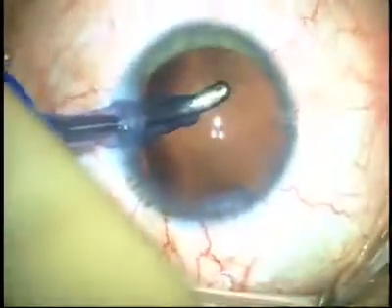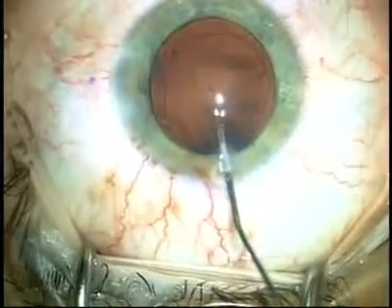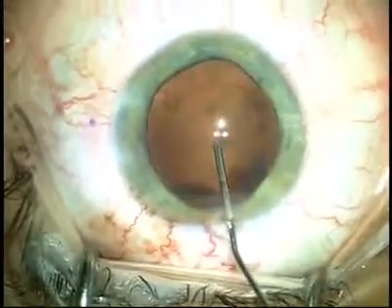As you can see, there's an exquisite detail inside of the eye because of the lack of viscoelastic during the irrigation aspiration.